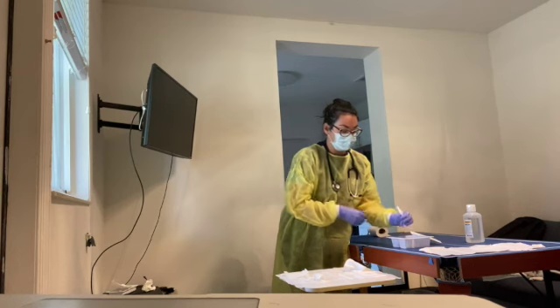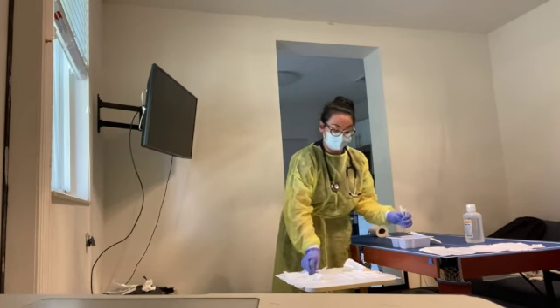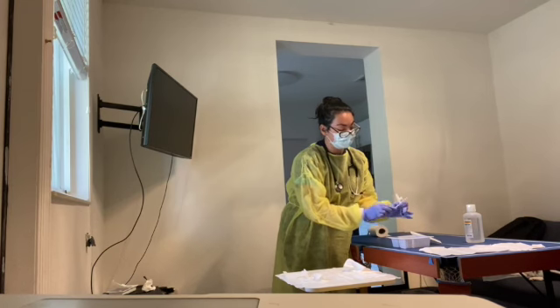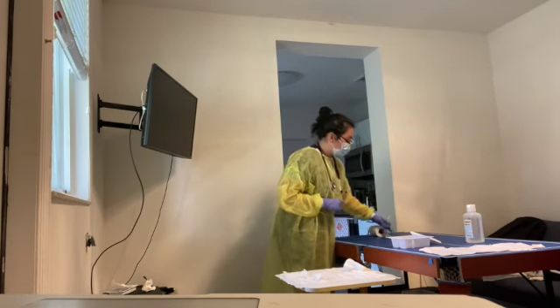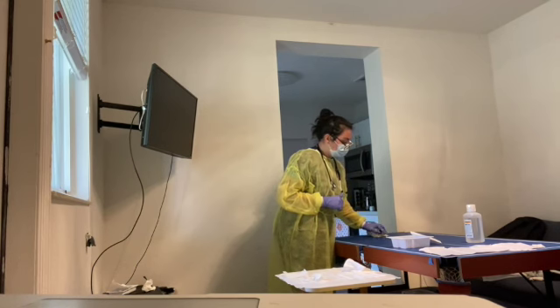At that time, I'm still with my non-dominant hand. I'm going to take the cannula and dry it with the pipe cleaner with my dominant hand. Make sure that it's completely dry. I'm going to dispose of the pipe cleaner while not passing through the sterile field. And at this time, I'm going to place the cannula back into the patient's tracheostomy with my non-dominant hand still in place.